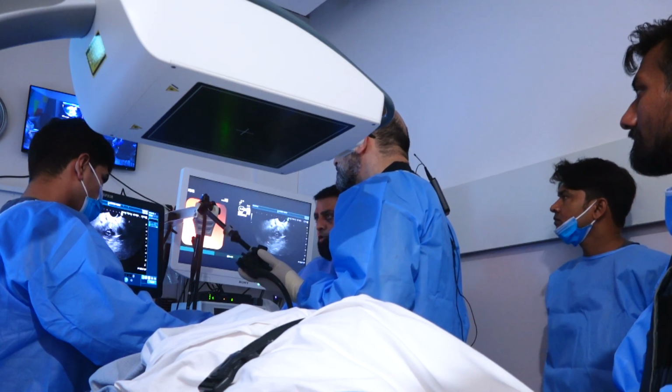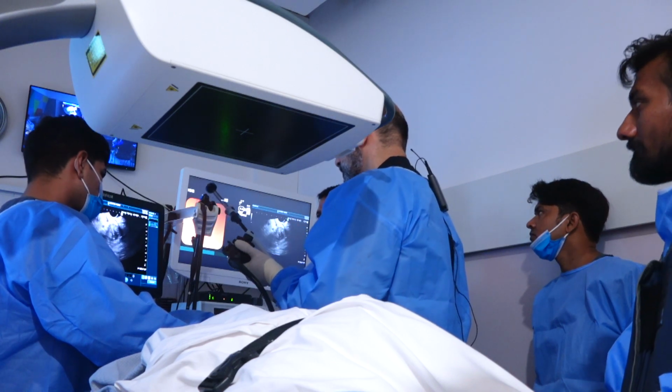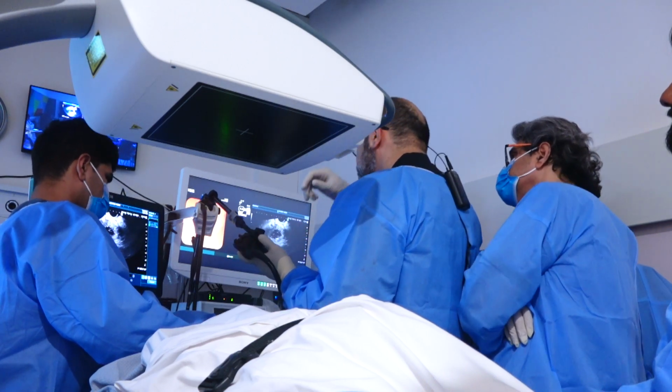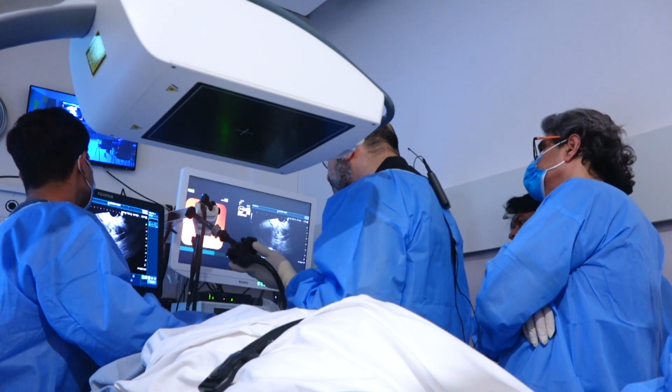Yeah, I think EUS and then we've got both your hands and EUS, which is what we want to see. We can leave the fluoro for now. Okay. So one of the things that happens is if you wait around, things move in the small bowel. So you don't want to delay this too much. But I think we're good here.